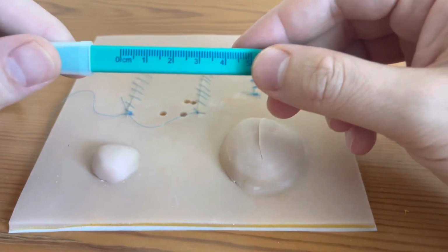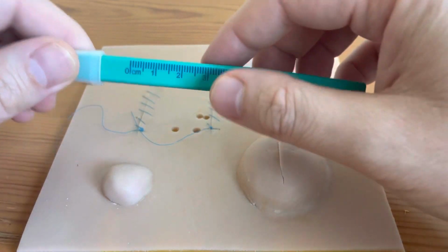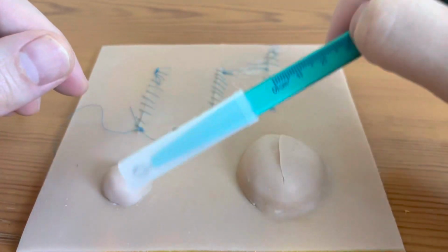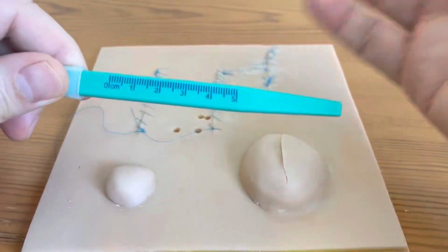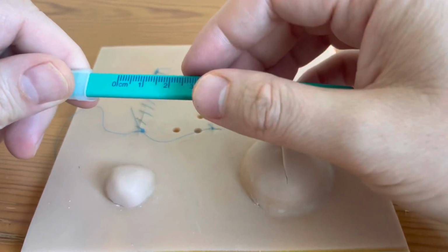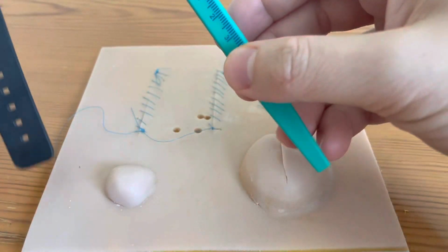Alright guys, I'm going to show you just how to measure a wound, a basic description on how to do it. You're always going to measure length, width, and if there's a depth, you would measure depth. So you get your ruler, any kind of ruler, that's going to be in centimeters, not inches. You're going to take your ruler and start with length.